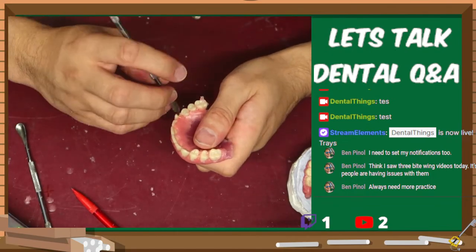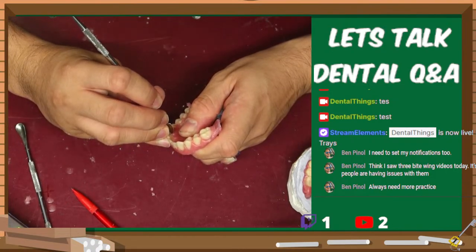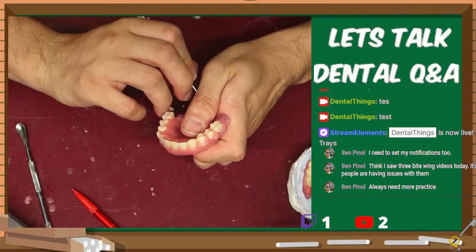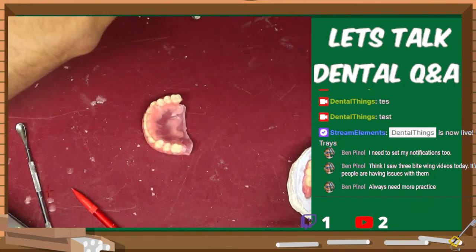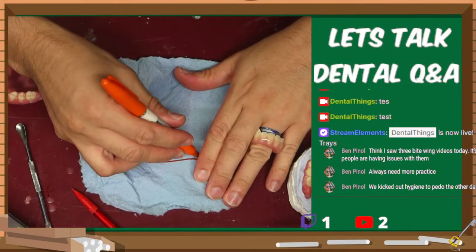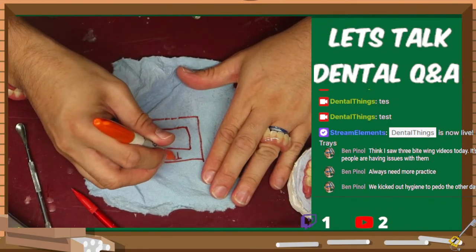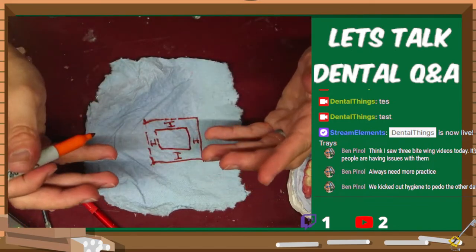Always need more practice. Everyone usually does. Sometimes it's not the person, sometimes it's the equipment that you have to use. Some of these X-ray sensors that are out there are super whack. The X-ray sensor is this big, but your only usable area that teeth will show up on is this big. So you have super big bezels on the outside that don't do anything but take up space.